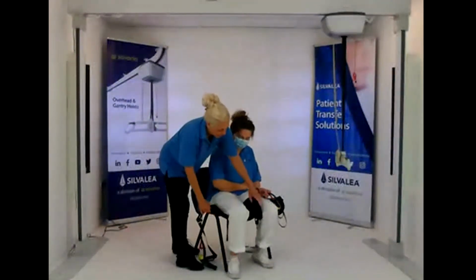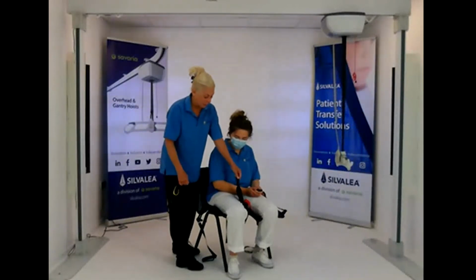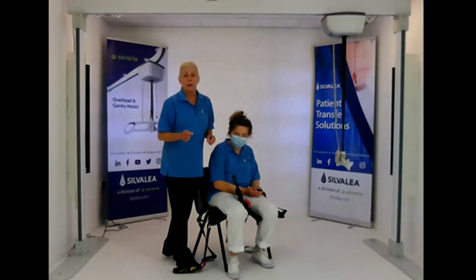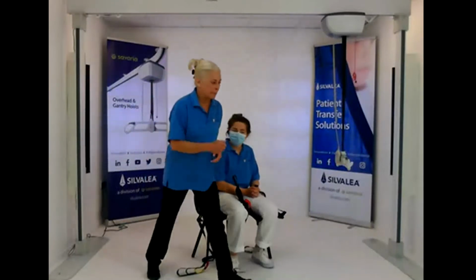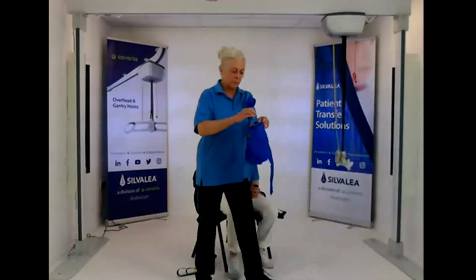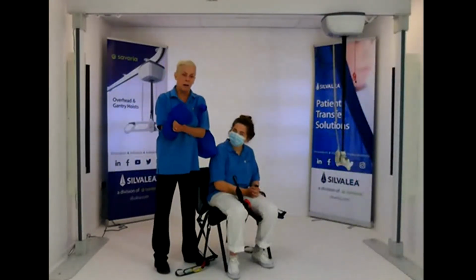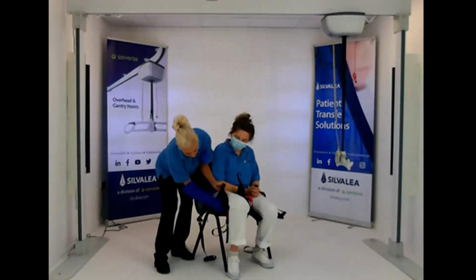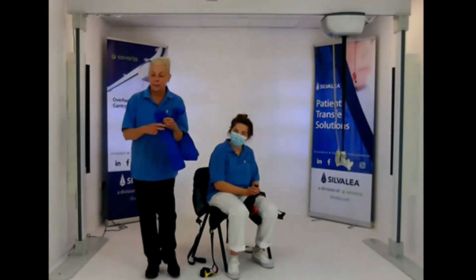Deluxe legs, so they wrap around. Again, this one's got the slip fit fabric around on either side of each paddle, so it's easier to get in. If you struggle though, there's lots of tips and techniques. Mitts, I think I've got a mitt. Slide sheets here. These mitts here, if you're getting something caught and it's hard to smooth it, then mitts are really good to check that you've got nothing snagging and catching.